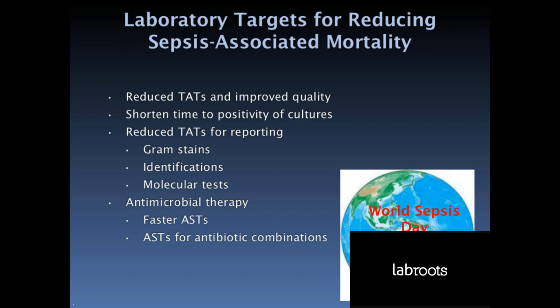Most blood cultures incubate for at least 10 hours before growth is detected. This time can be reduced if the positive signal can be amplified to make it stronger and therefore detectable earlier. Other ways to achieve faster detection would be to enhance the sensitivity of the detector of the blood culture system or find a better target and detection system.